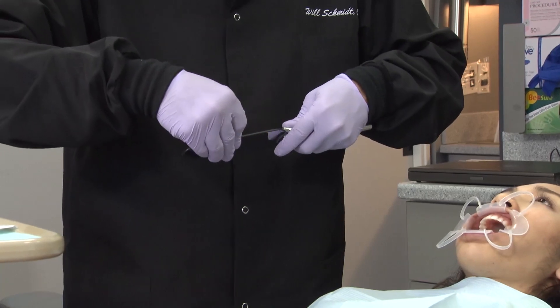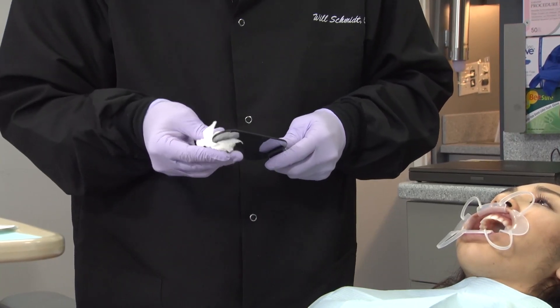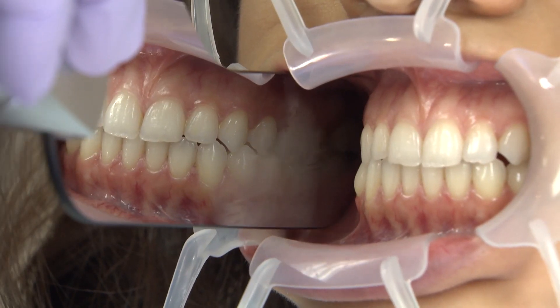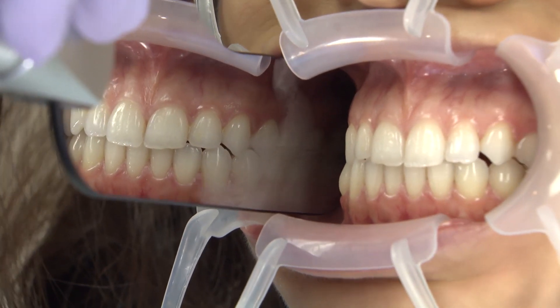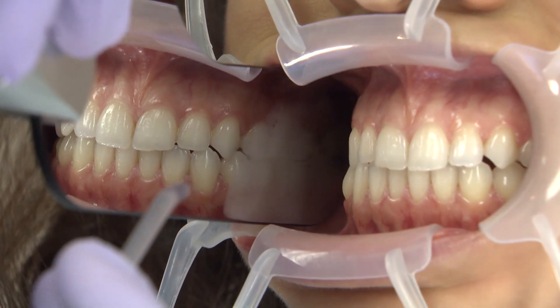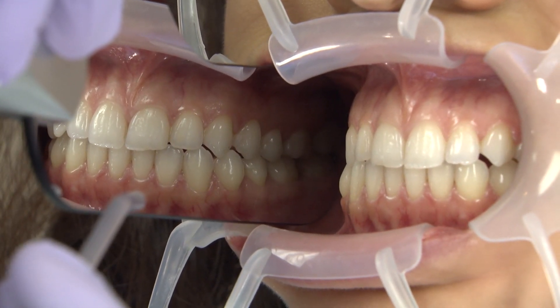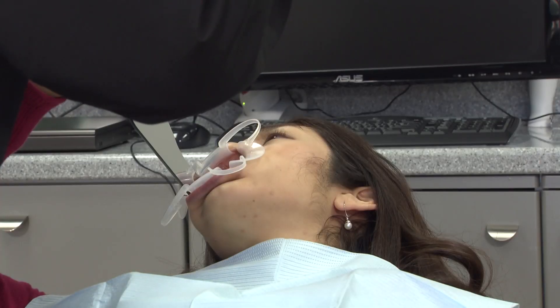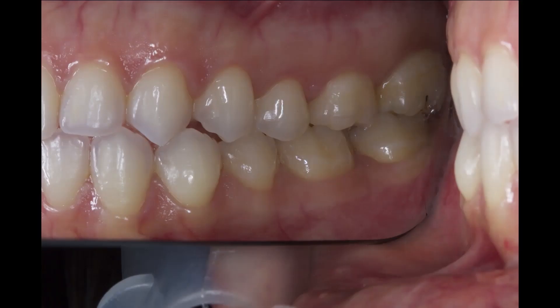Moving around to number 30's buccal view, give the mirror a quick wipe with a tissue to clean off any dried saliva smear and place the mirror into the vestibule before asking the patient to bite down. It is most evident at this angle the need for a constant air stream to dehumidify the reflective surface and wash away saliva interferences. The ring flash on this camera is crucial to bring the correct amount of light into the posterior and illuminate the tooth as true as possible.